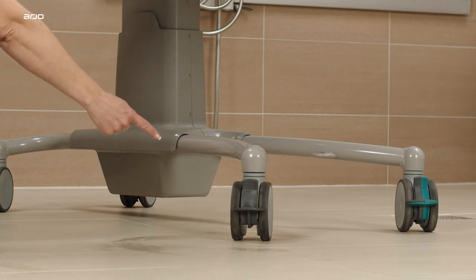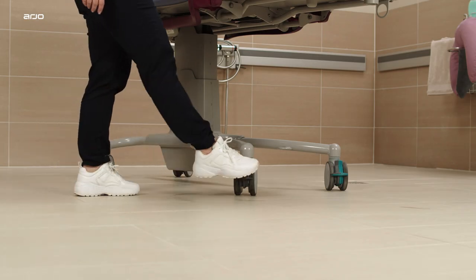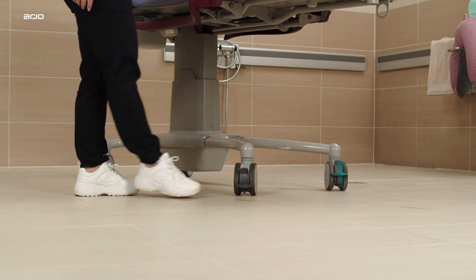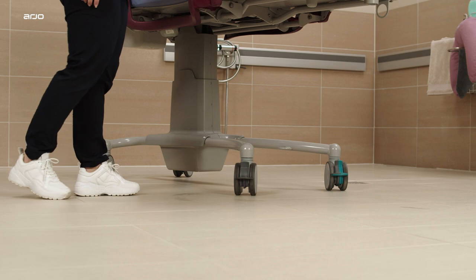The caster brakes are located on all four casters. Apply the brakes by pressing down on the grey caster brake lever, and release by gently kicking up the grey lever.